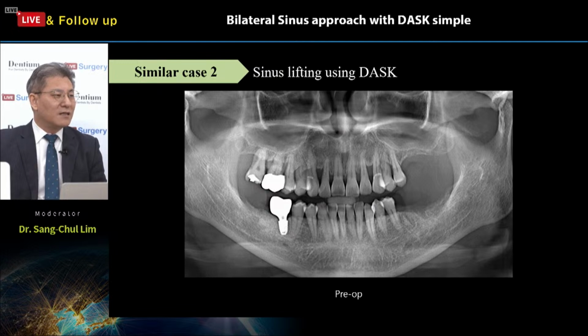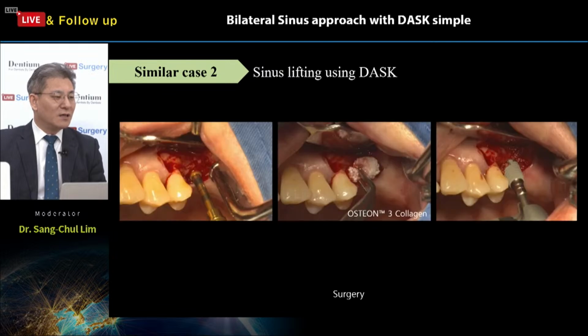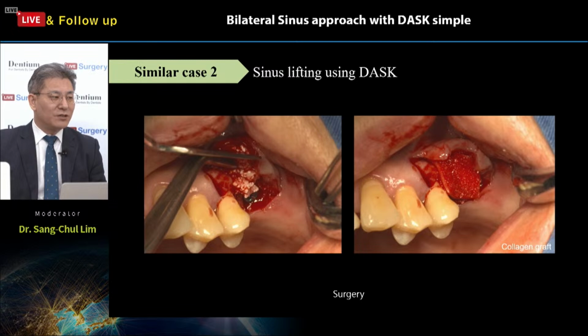Okay, sinus lifting using DASK, also a similar situation to the previous one. This case shows how to use the Osteon 3 collagen and the crestal drill combined with the Bright implant, covered by this collagen graft instead of collagen membrane. What are the advantages of using collagen graft instead of collagen membranes? Okay, I will explain later.